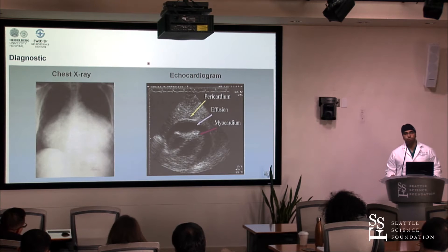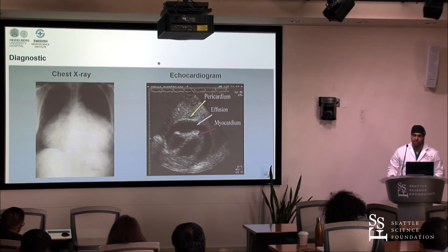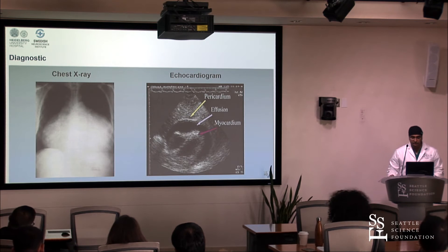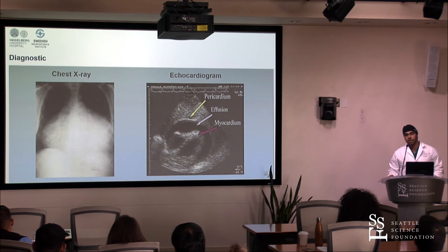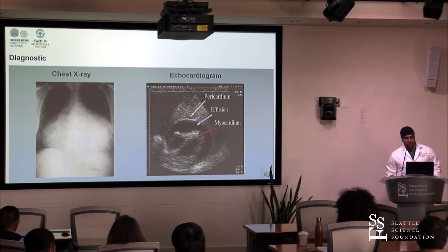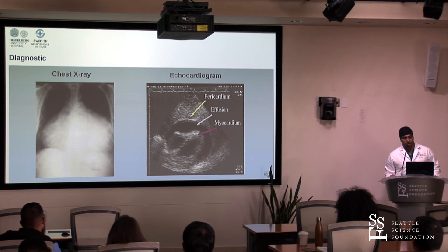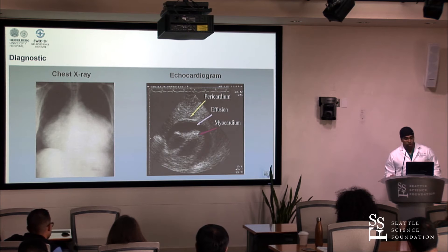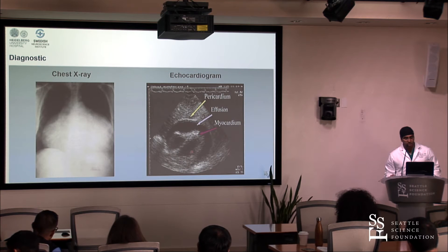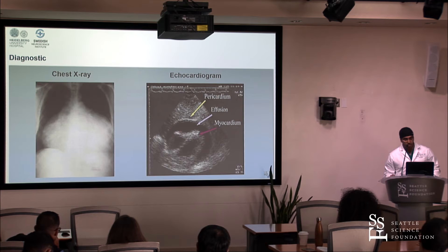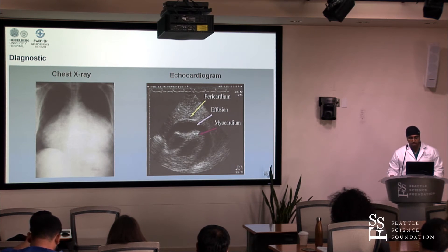The diagnostic is pretty simple, though it depends on who is doing it. You can do a chest x-ray — it's clear, but not always that clear. The most sensitive diagnostic tool is the echocardiogram — the echo. You can really distinguish between a pleural effusion and a normal heart. As you see here on this image, this is the normal heart — this is the right, this is the left ventricle. You see there's an echo-free space, which appears black, between the epicardium and the pericardium. And you see there's something wrong — there might be fluid inside.